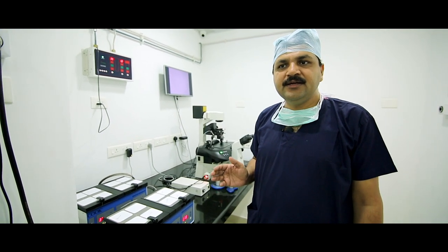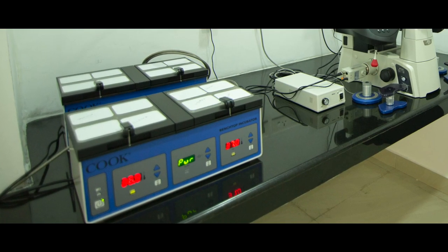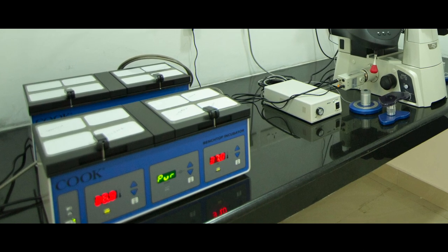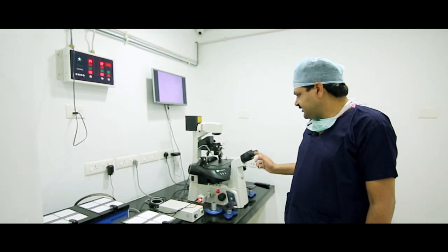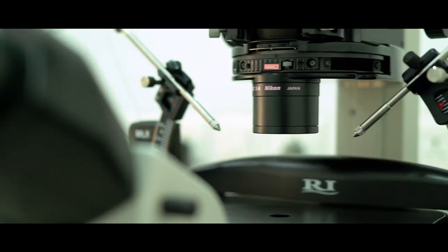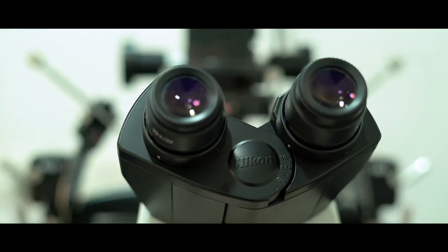ICSI stands for intracytoplasmic sperm injection. In this technique, we retrieve spermatozoa from the testes and isolate them. For ICSI, we need an inverted microscope with a micromanipulator. We have an Integra 3 RI machine, which is a very highly modified machine.